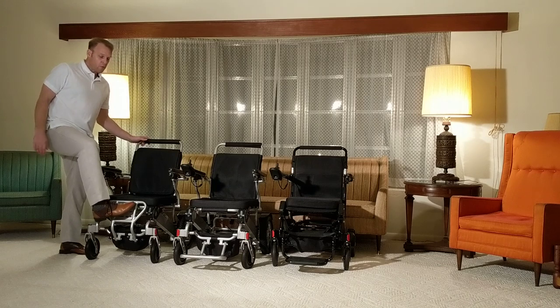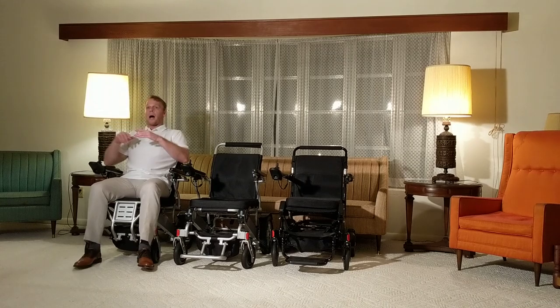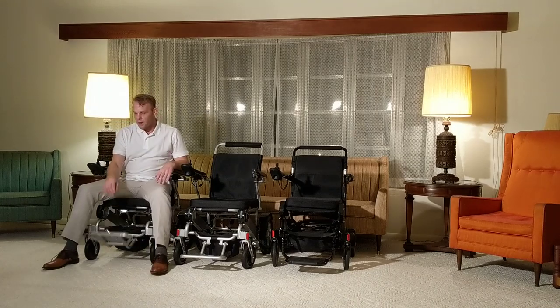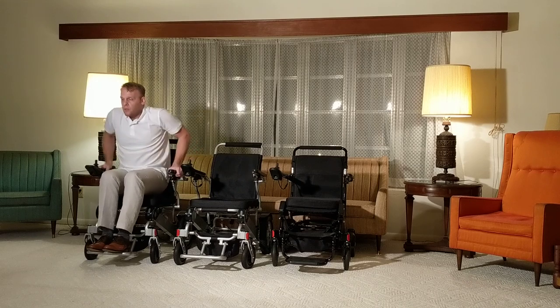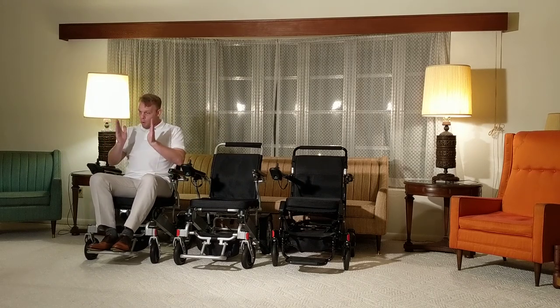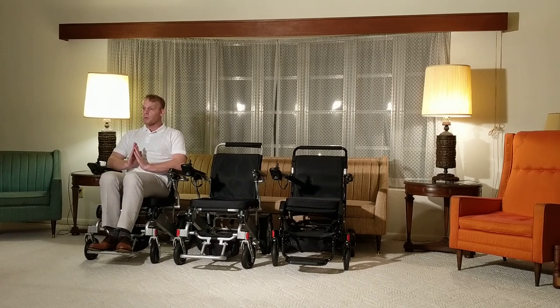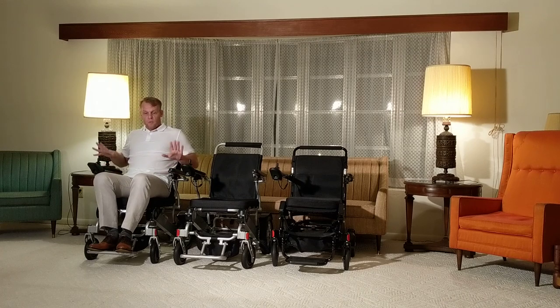Moving over to the Electra 7 wide version — same thing: the footrest folds right up, very easy to put back down. The arms are very strong and can hold a lot of weight. It holds up to 400 pounds, so whether you're tall or wide, you're most likely going to find this chair very comfortable.